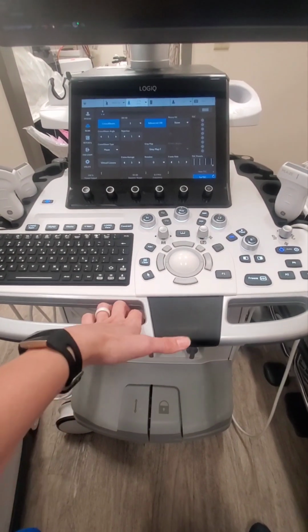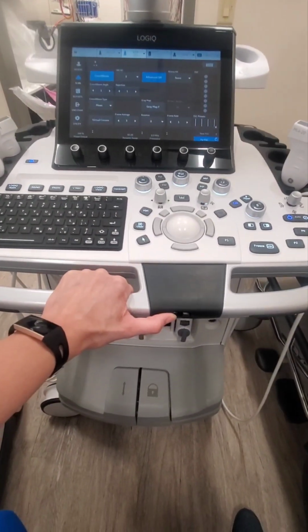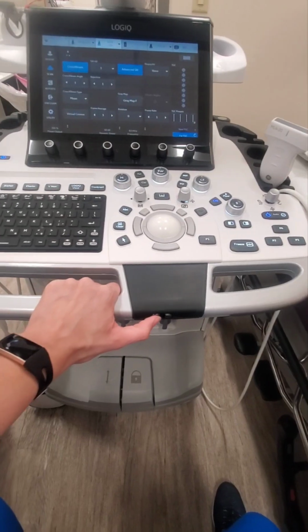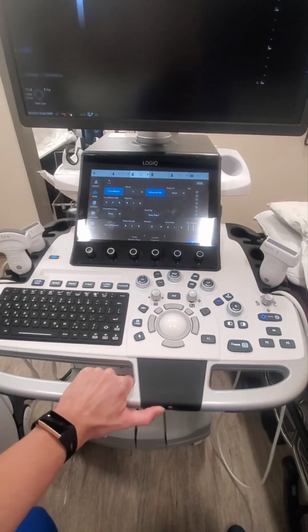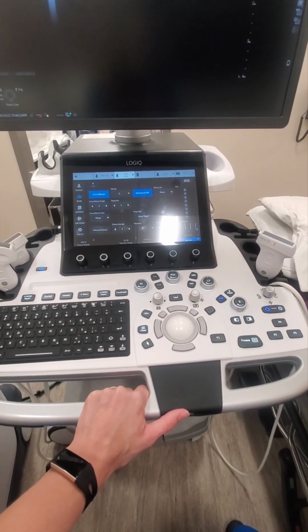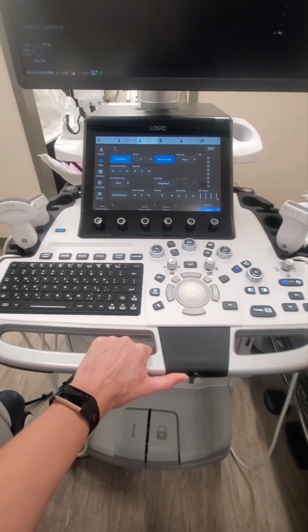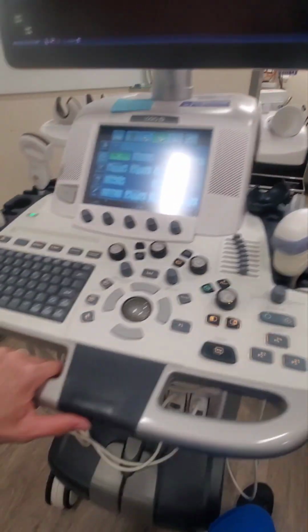It's important that it's locked if you're going portable and you need to push the machine, otherwise you can have it unlocked. And then this one has like a power steering, so you want to keep that button pushed down while you adjust your console, and then you release it, and then it's going to kind of lock itself in place and hold still for you, which is awesome. But you don't want to just grab it and try to whip it around and overpower it, because you can break it.